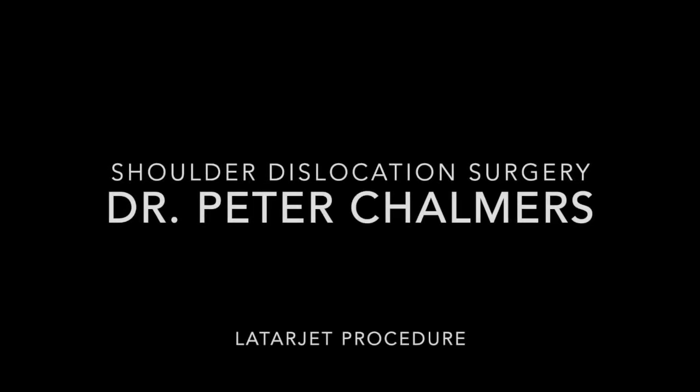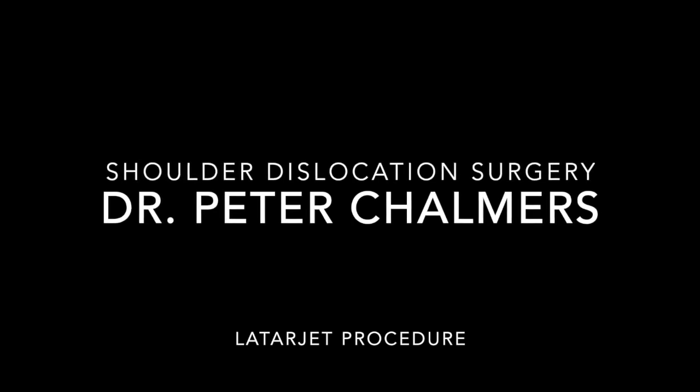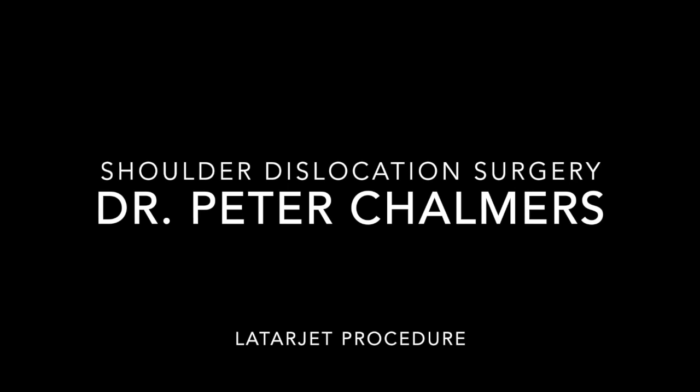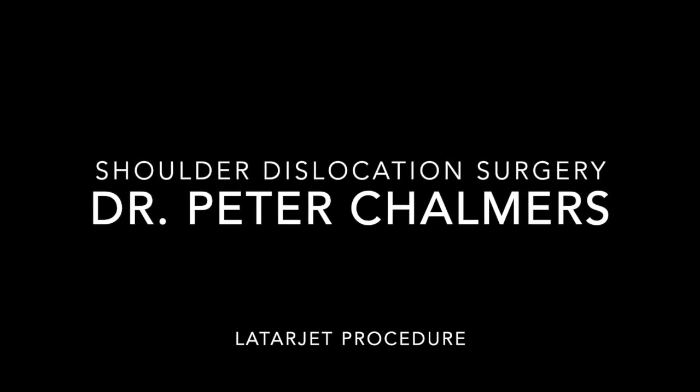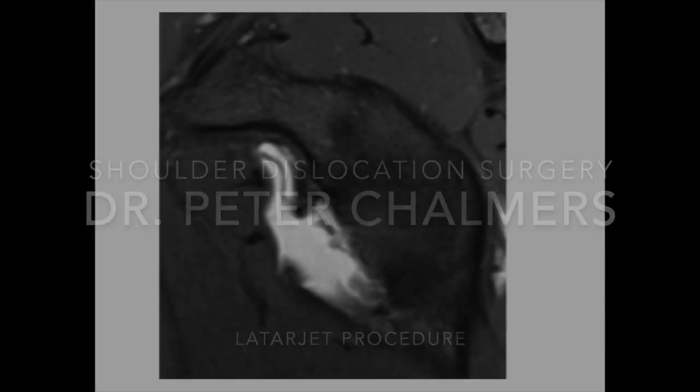Hello, my name is Peter Chalmers, and I'm a shoulder surgeon at the University of Utah in Salt Lake City. The purpose of this video is to show the surgical technique for what's called the Latarjet procedure. This is a procedure done for a shoulder dislocation where there's also damage to the bone of the socket of the shoulder.